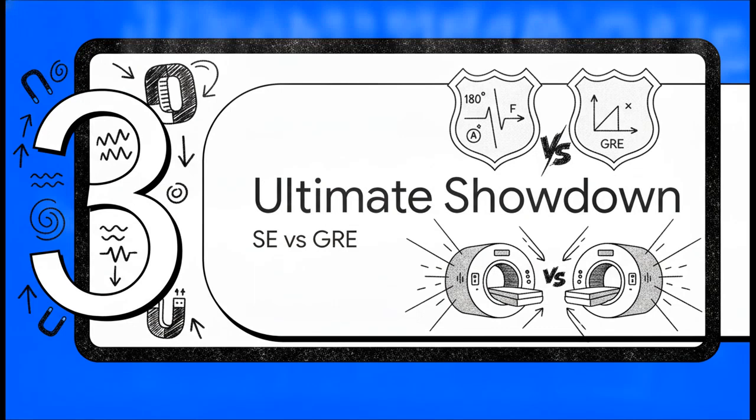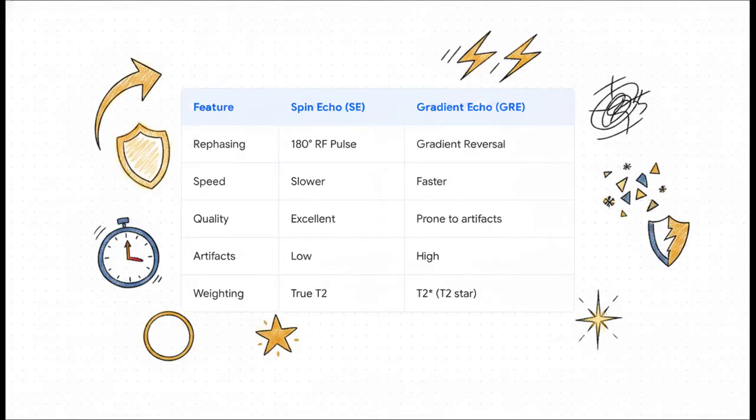Spin echo versus gradient echo. Let's put these two head-to-head to really solidify your mental framework. Think of this as your ultimate cheat sheet for your exams and your daily practice.